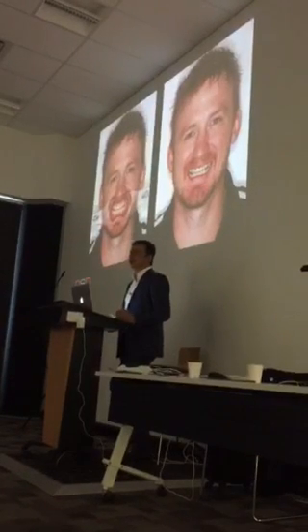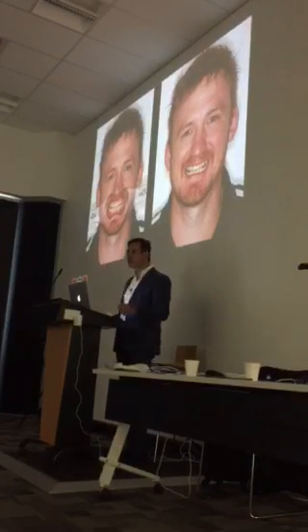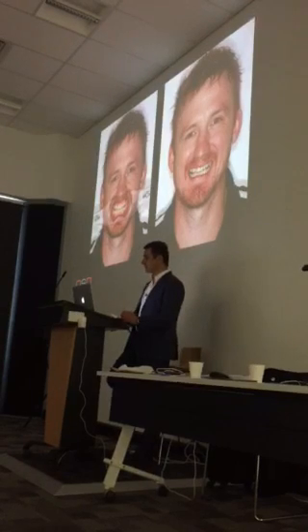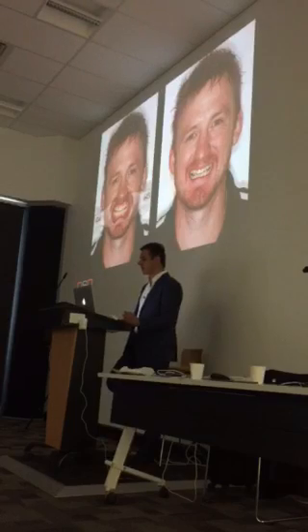Again, these are mock-ups. Ideally, a patient like this, I would love to move them from 6 across to 1. Orthodontics would be ideal, then we'd look, but he insisted he doesn't want orthodontics, he wants veneers yesterday. So we did a mock-up and we look at the options.